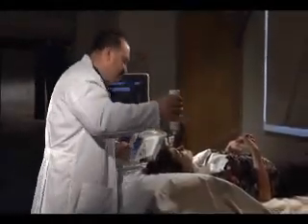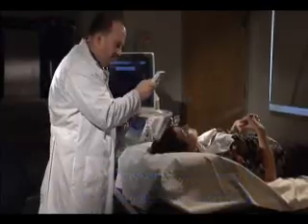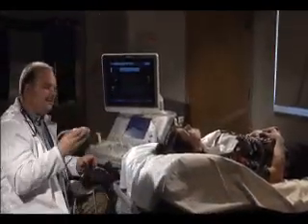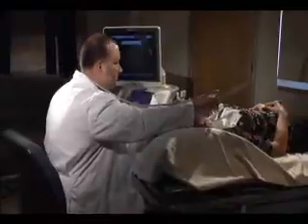Okay, Amy, I'm going to put some gel on your neck. Okay. What the gel is for is to get rid of the air between my ultrasound transducer and your body. Sound waves go very, very slowly through air, so unfortunately without the gel to get rid of the air, we don't actually get a picture.